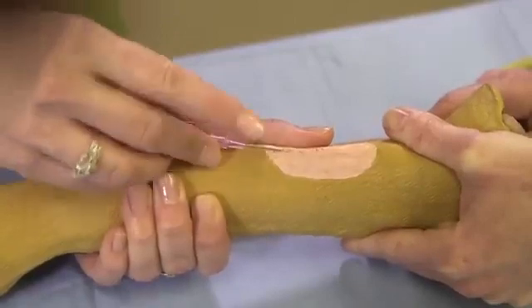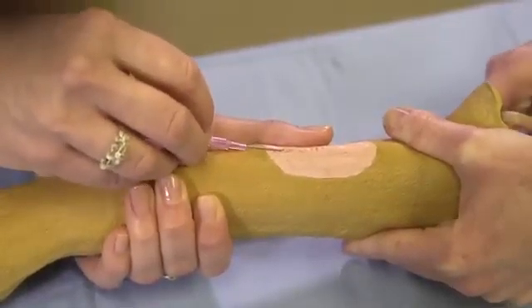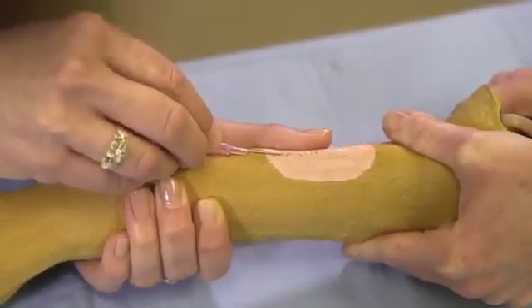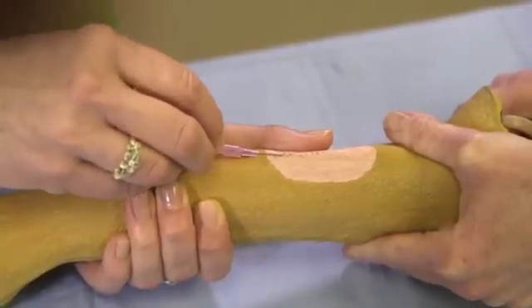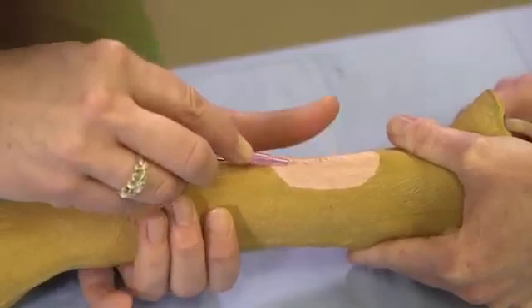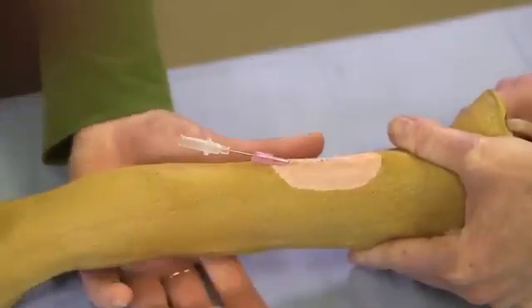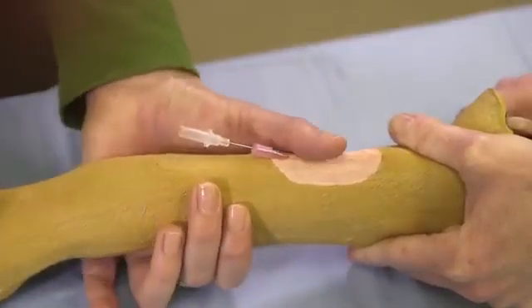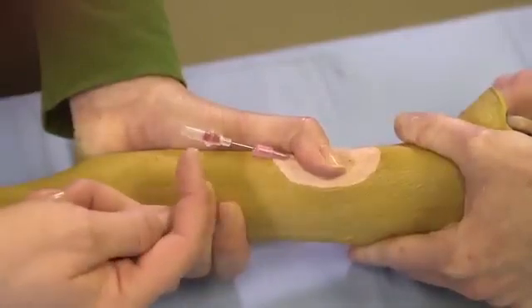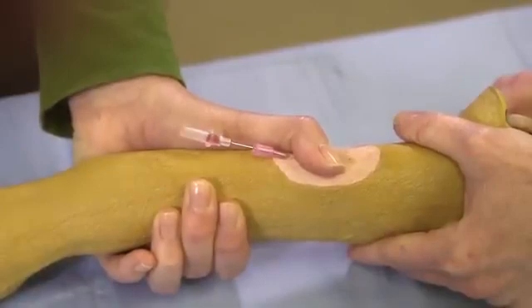I've got my first finger here ready to push that catheter off. I'm going to hold still where my fingers are, hold my stylet still, and push that catheter off into the vein. Then, once I pull my stylet out, the blood is going to want to gush out of the catheter. So I'm going to take my thumb, hold off, and you can see the blood is wanting to come back. I'm going to have my T-port ready.